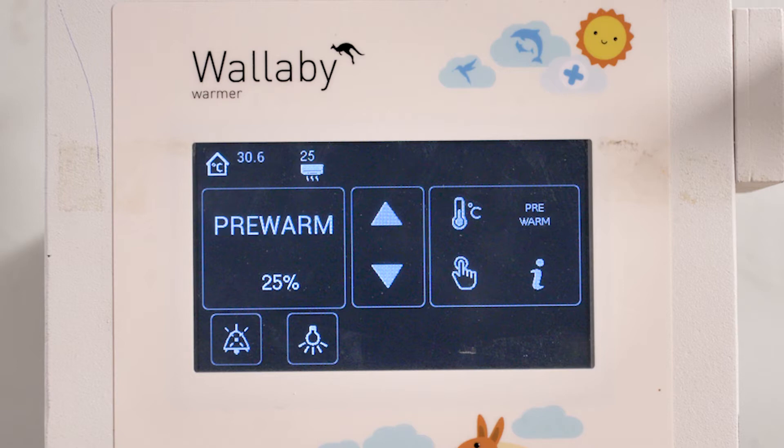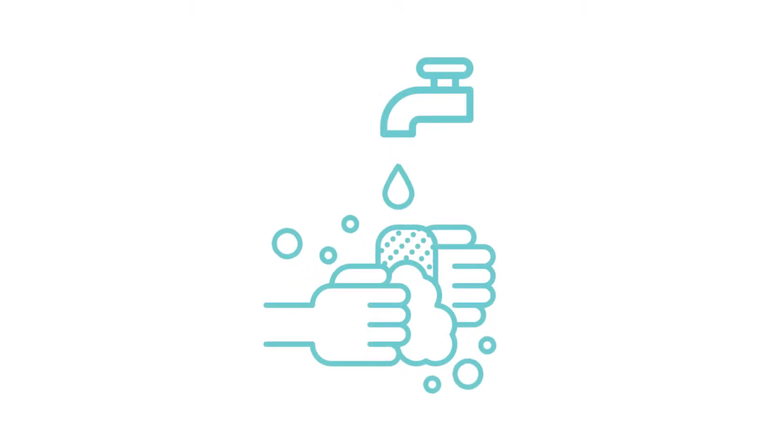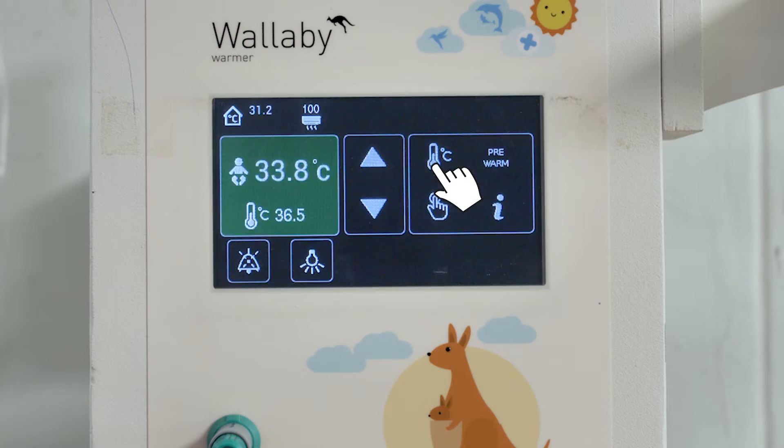Before you place the baby under the warmer, make sure the cot has actually warmed up. Also wash your hands and put on gloves. Now switch to servo or baby mode.